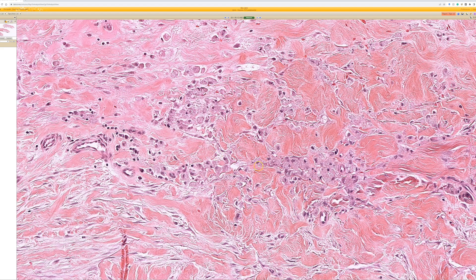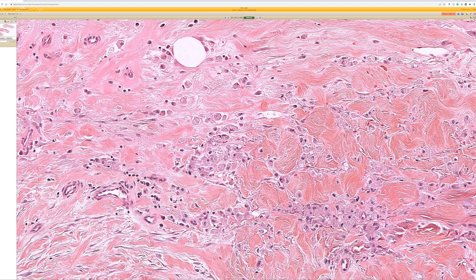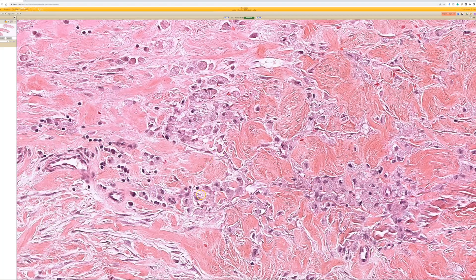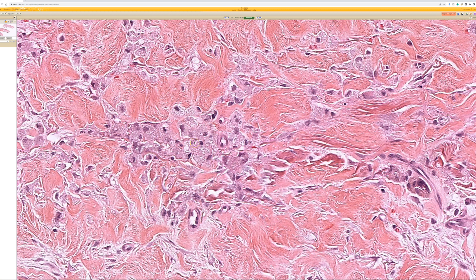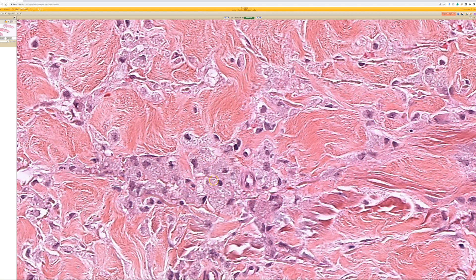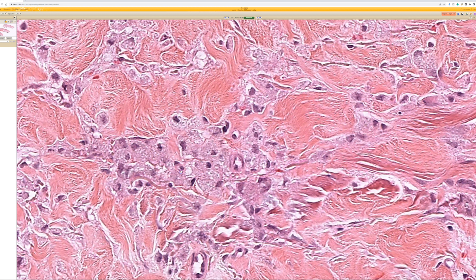What we get microscopically, in addition to the scar, is a variety of changes. You will see histiocytes of variable amounts - it varies from case to case, possibly depending on how much Drysol is used, the anatomic site, and how long after the biopsy we see the excision specimen. In this case you get these histiocytes with increased granular bluish-gray, stippled, speckled cytoplasm - you can see these dots in the middle with grayish-blue cytoplasm on these histiocytes.